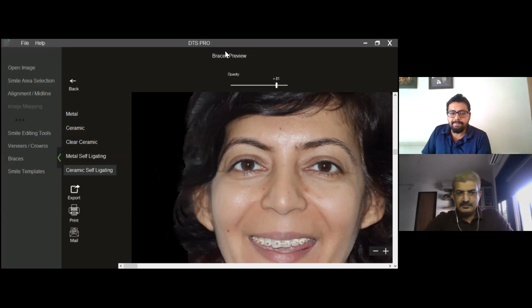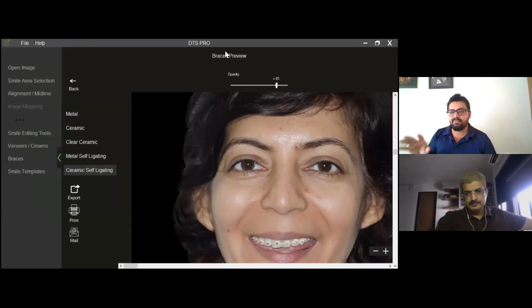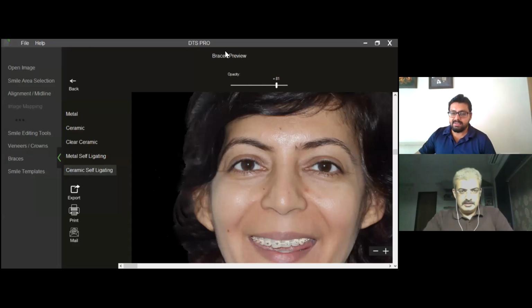Okay. There's a question from Dr. Vijay M. on software backup and tech support. Basically, everything remains inside your system. You can export it in the form of either a JPEG or a PNG file that remains within your system, or you can save the whole thing as a project file, so that if the patient comes and you want to show the whole thing again, you can. Again, the backup remains in your system for sure. And as far as technical support, yes, we have a team here which takes care of it if there is any issue.